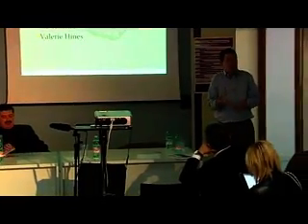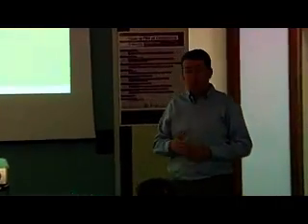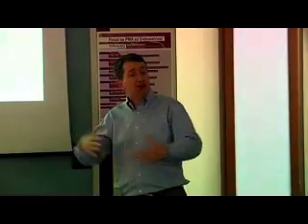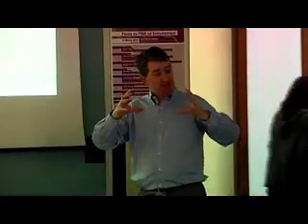This is a very common question. A lot of IVF labs, even in the United States, where patients are paying cash a lot of time for their IVF cycles, still don't have a laser, because the laser for us is a $30,000 piece of equipment. So a lot of programs don't have a laser. You can collapse them with a needle. You don't have to collapse all your embryos. You really just need to collapse the embryos that are at that expanded blastocyst stage.